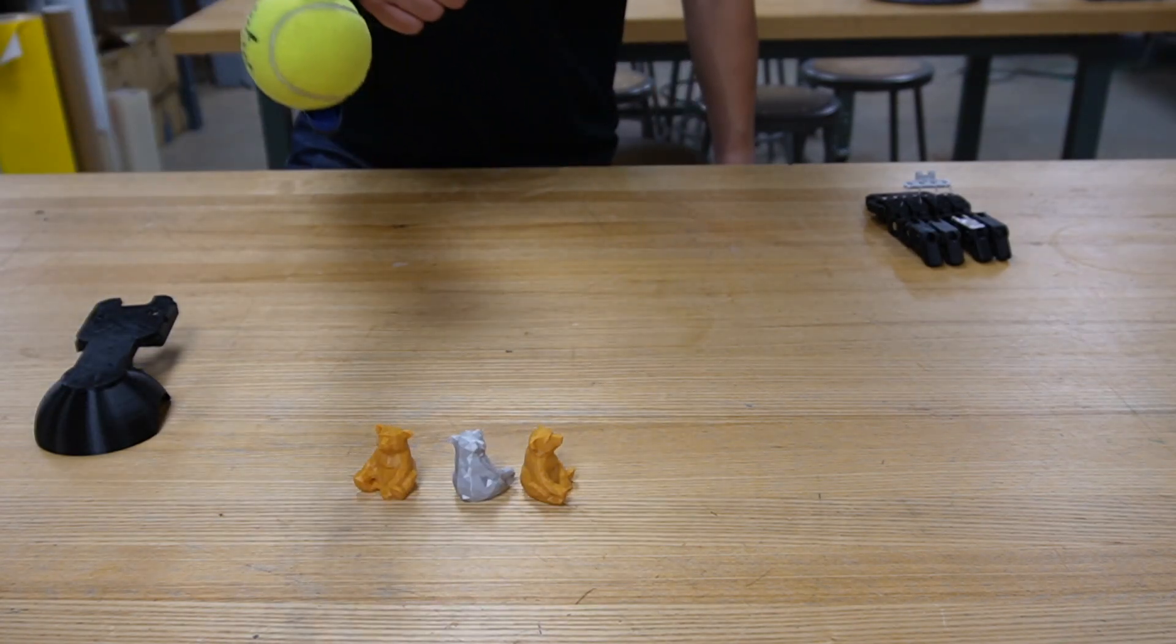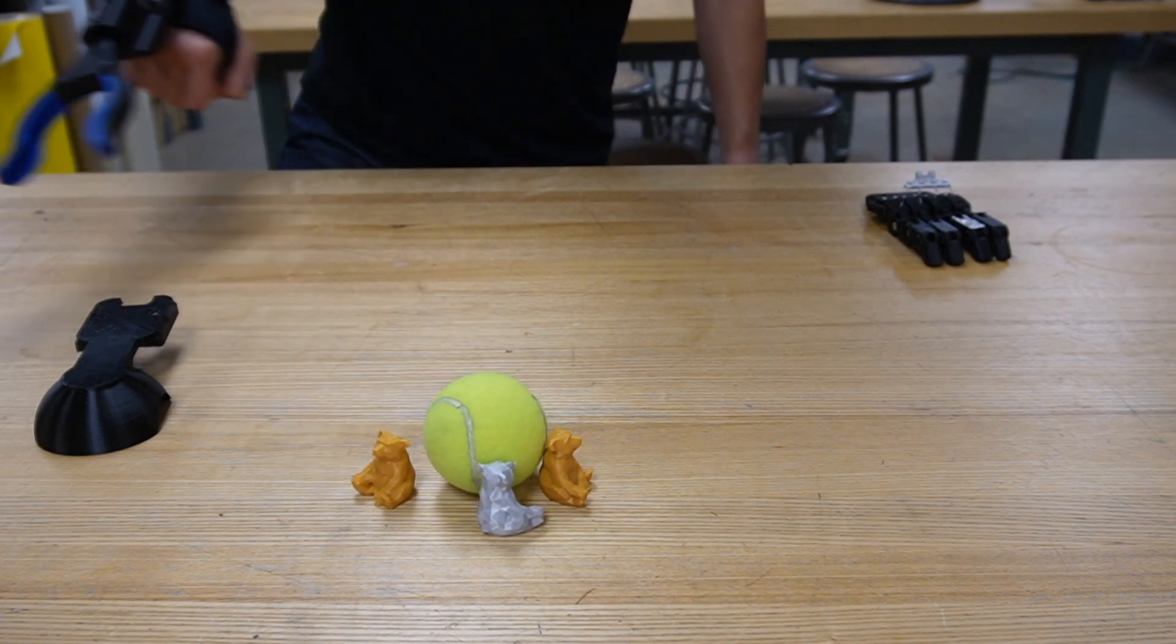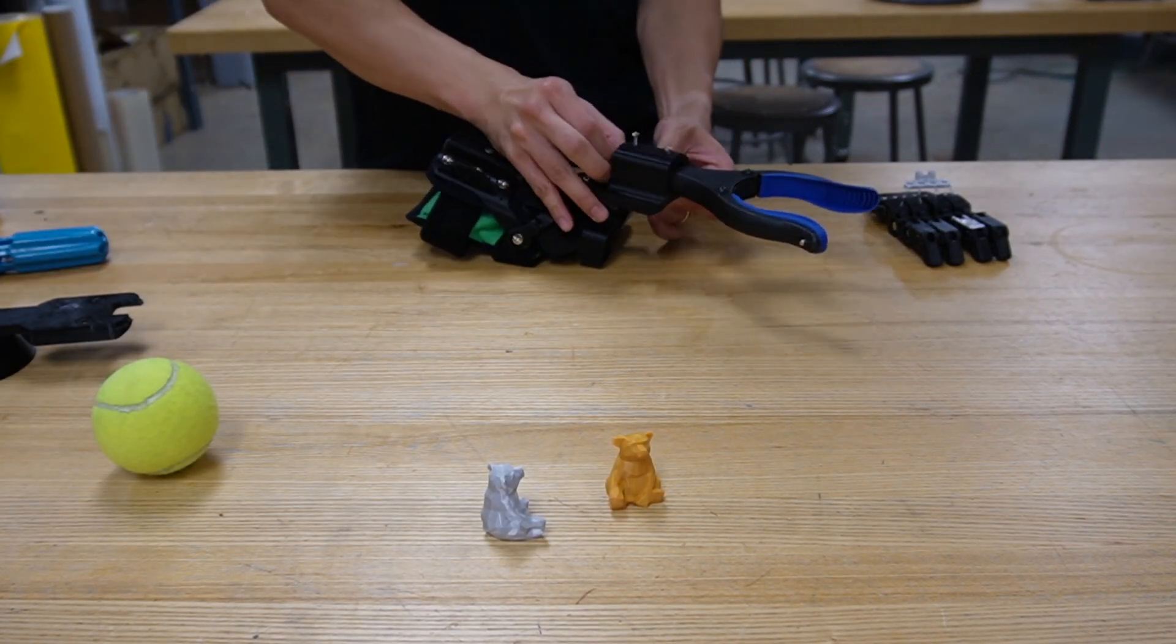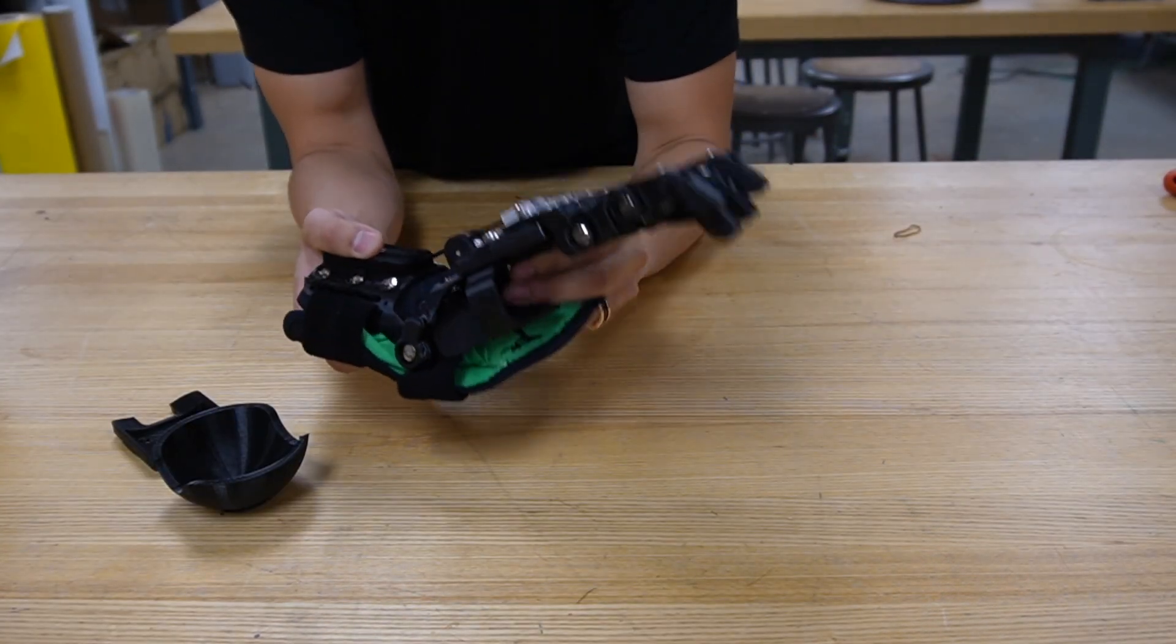The demonstration shows how easy it is to grab things with a simple grabber, and also how easy it is to swap between different modules such as robotic hands.